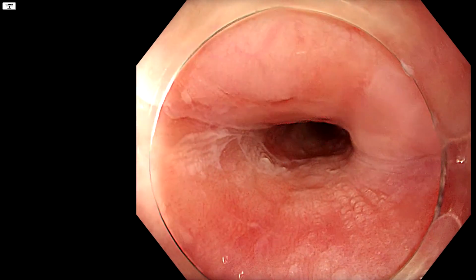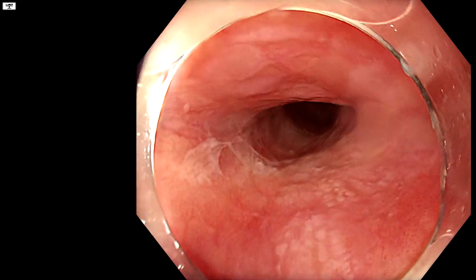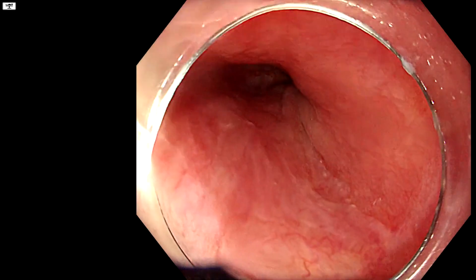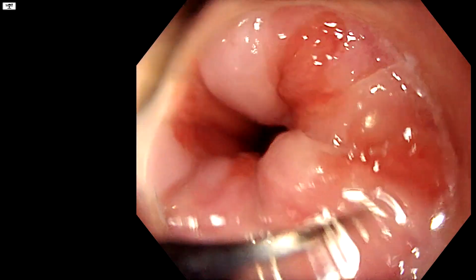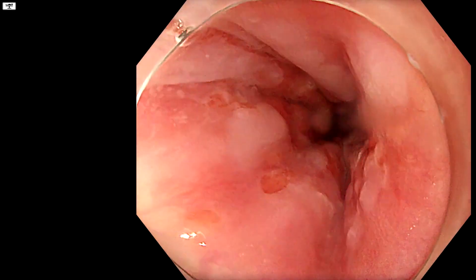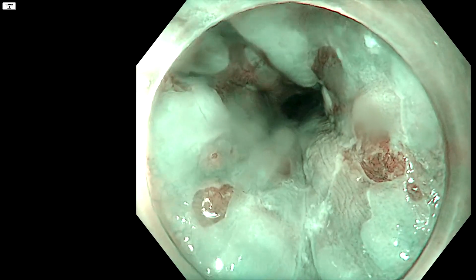And as happens after this sort of thing, the patient enters surveillance. There's a little relative stenosis there, you can see. The patient enters surveillance and then is having biopsies, and one of these biopsies shows high-grade squamous dysplasia.